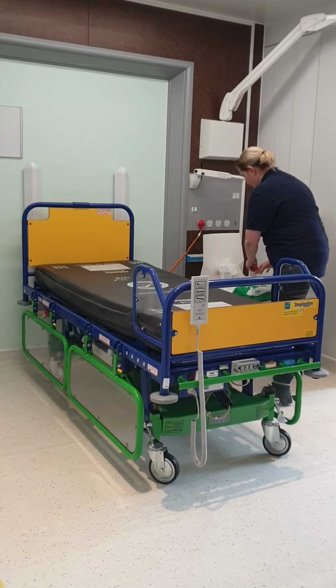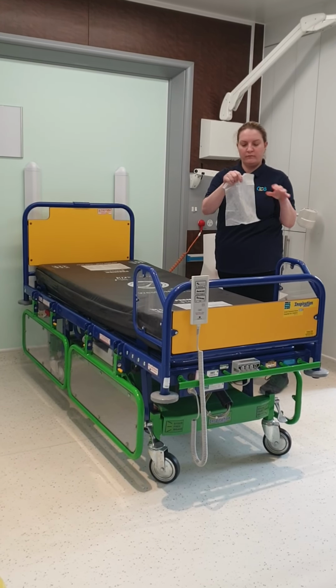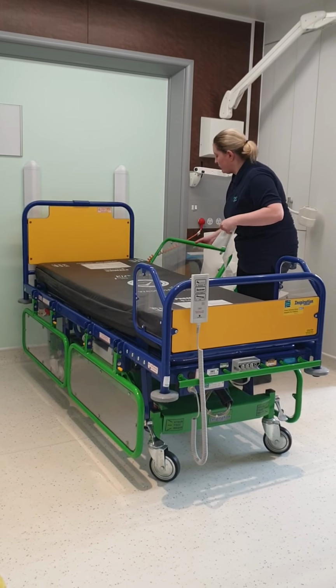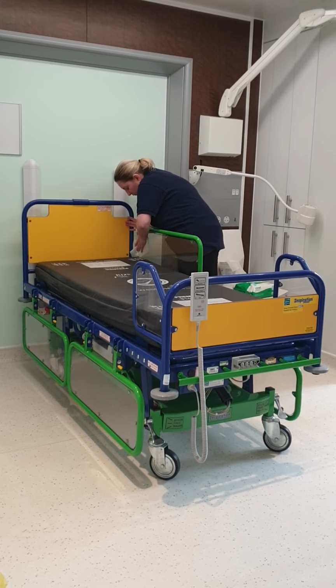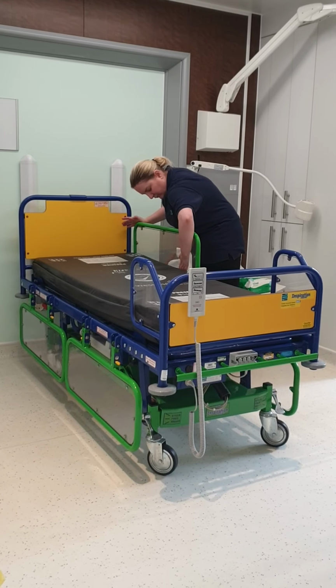So once you've done with the mattress, we're now going to start cleaning the bed frame itself. This is because bed frames are frequently contaminated, especially items like bed rails, where people regularly touch the bed, not just patients, but also staff and visitors.